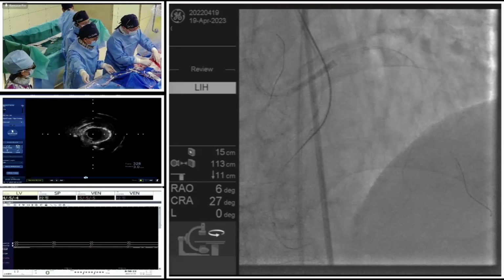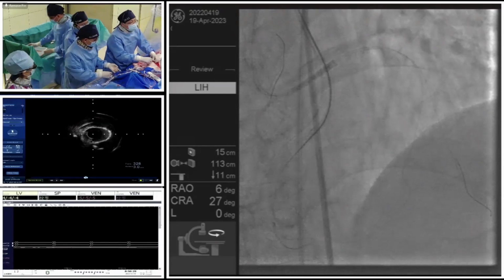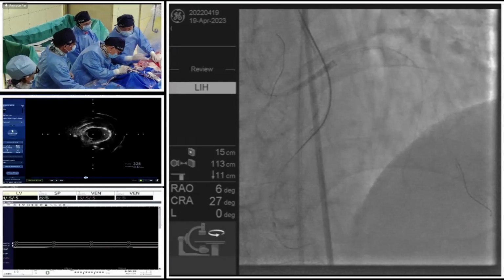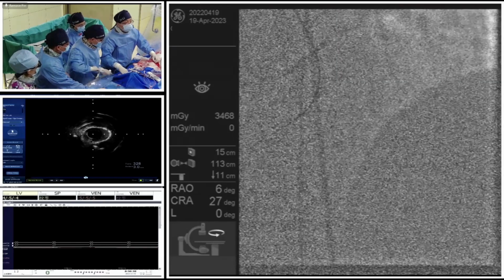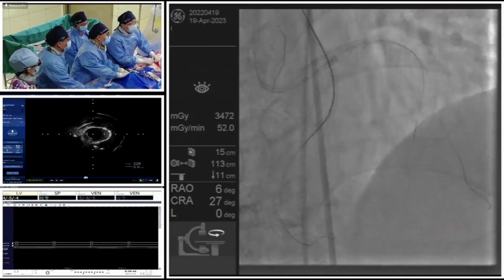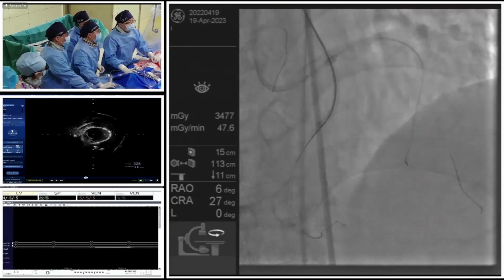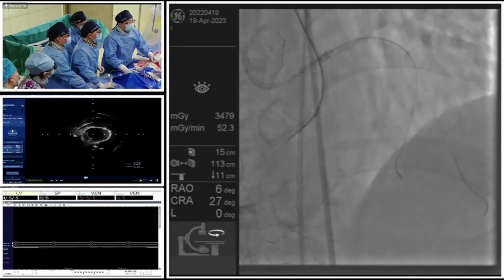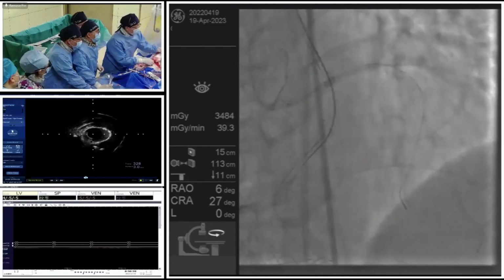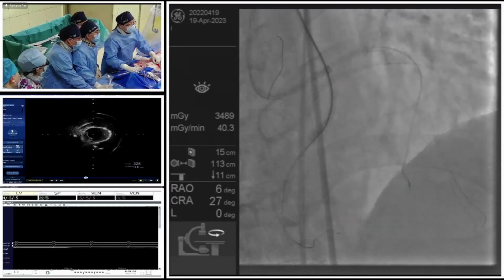Yes, we don't want to see some contrast residue from the septal. Also, septal collateral channel perforation in most conditions is benign. Sometimes also could deflate. Actually, for the microcatheter, I invented a technique where we use the FineCross microcatheter to assist the silk suture or absorbable suture embolization technique. Yes, it's very useful for small vessel perforation.